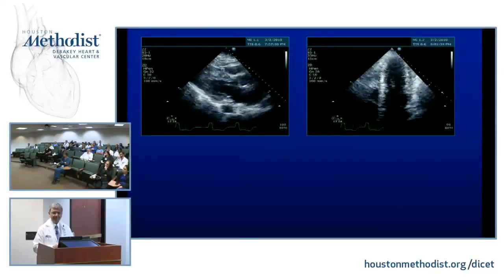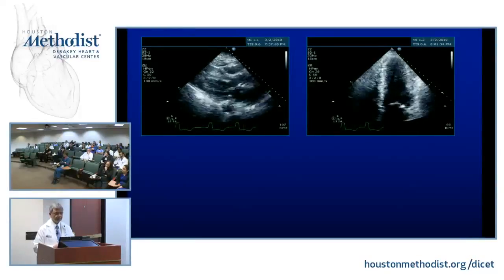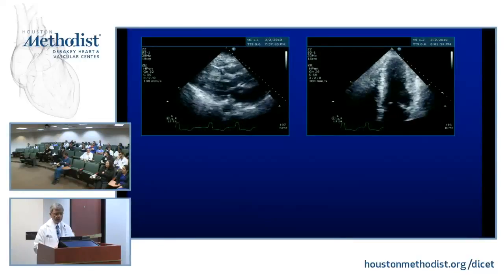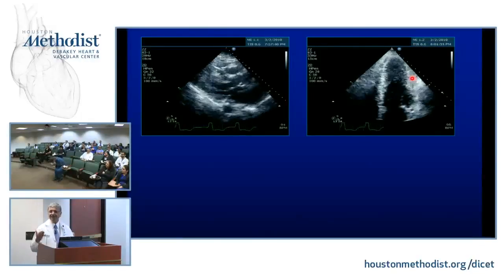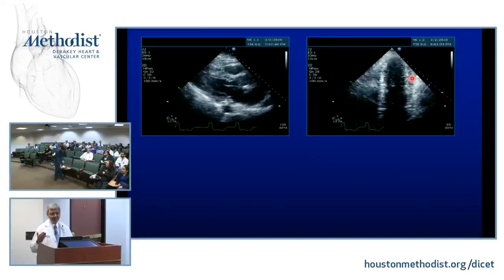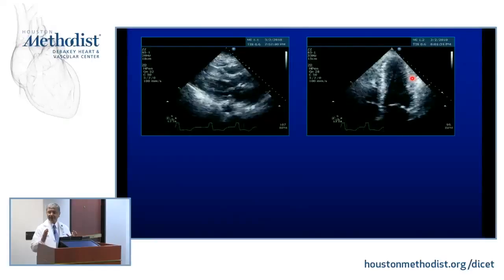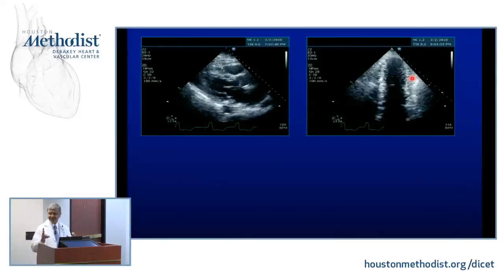Looks like akinetic here. Huh? Looks akinetic, but it could be just apical hypertrophic also. Or an apical hypertrophy. True. That's your differential diagnosis. Notice one hint also, as to the abnormality, see this? It has to move. Okay? Endocardium moves much more. Epicardium moves about 10%. So if the epicardium doesn't move, you've got two choices: akinesis, or it just doesn't have anywhere to go.